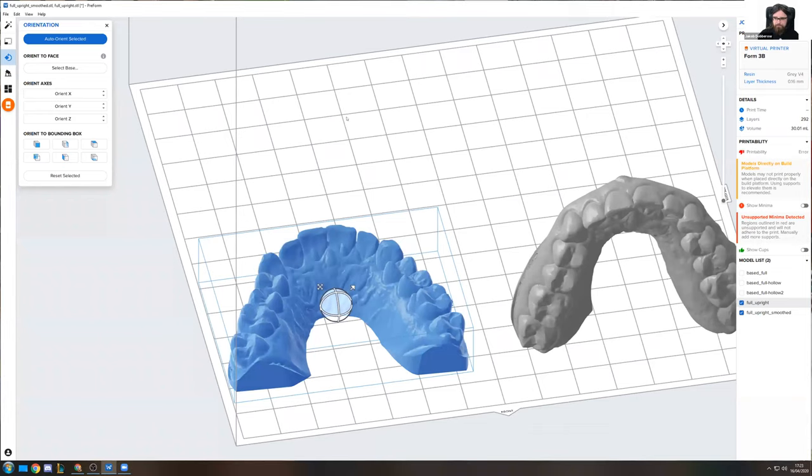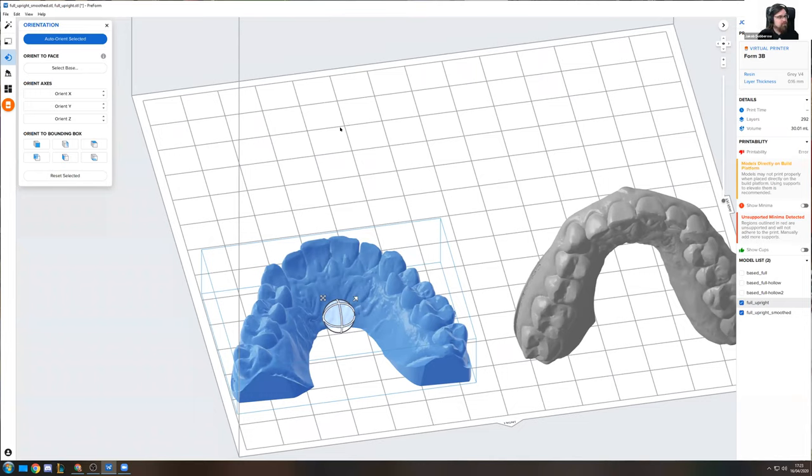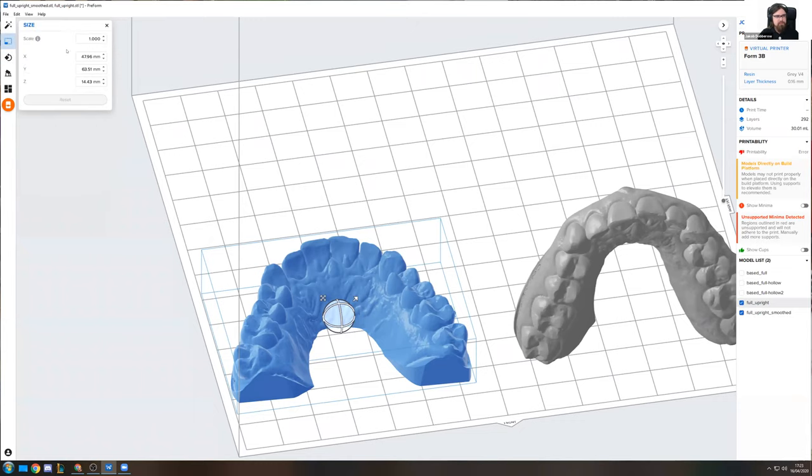Generally speaking, I would always recommend doing an offset like this in the software before exporting it as an STL file. That is usually a bit cleaner and a bit easier to do. But if you do want to scale models, you can definitely do that. It's on the left side right here, right under this wand that you have. And the next one right under it would be the sizing feature. So that is for scaling.